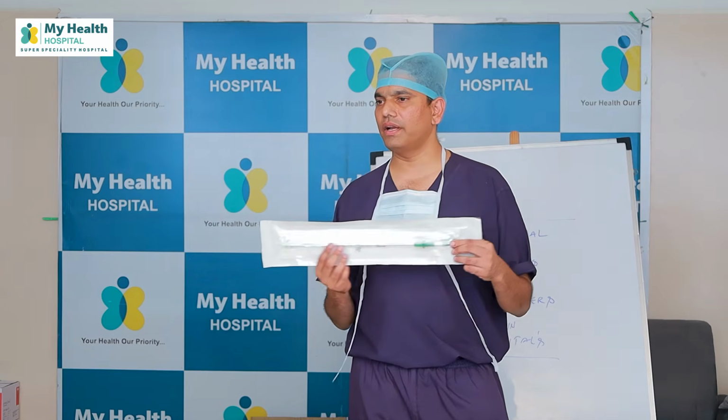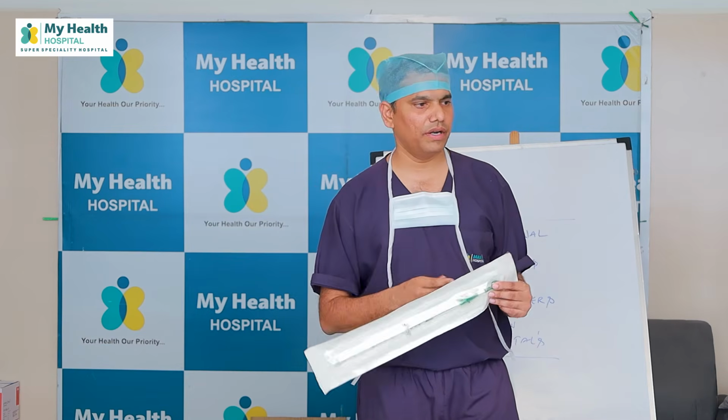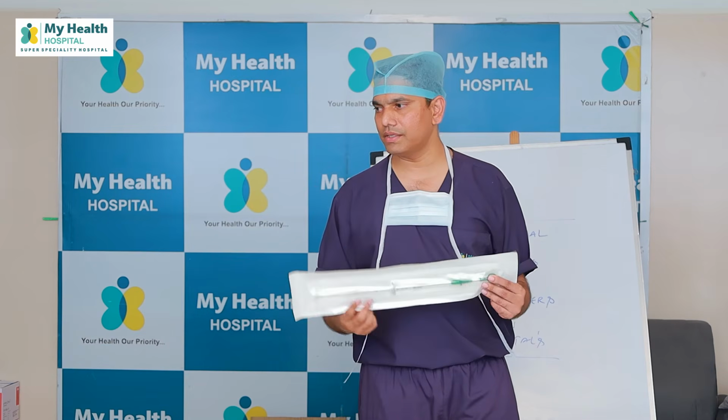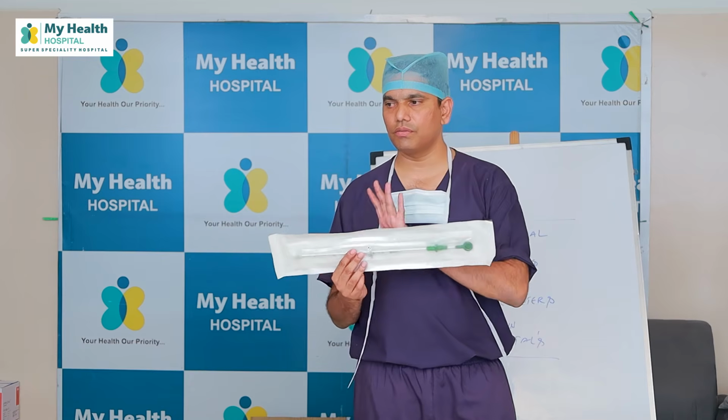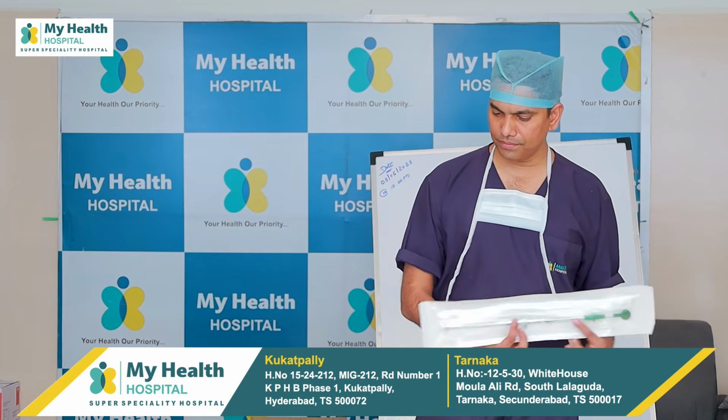Ideally, no. But in times of emergencies, clamp one side, push it inside, and connect it immediately before the air escapes. But ideally, chest drains are supposed to be used for chest drains. Abdominal drains are supposed to be used for abdominal drains. Okay. We connect it to a drain bag.